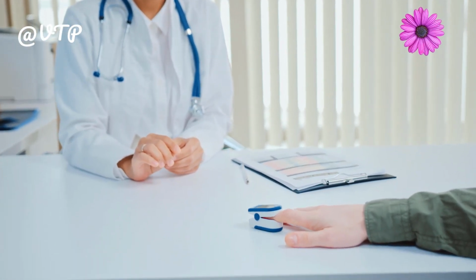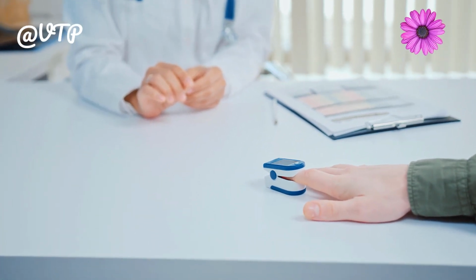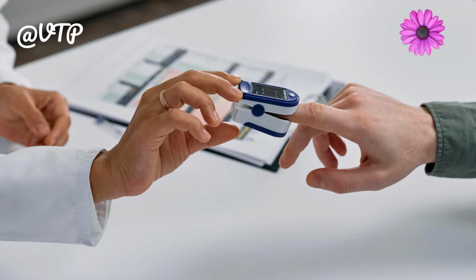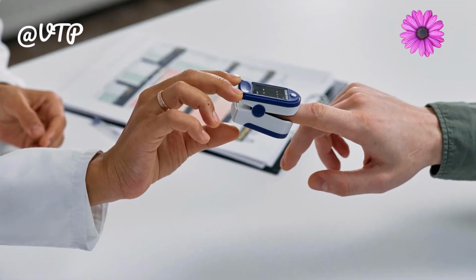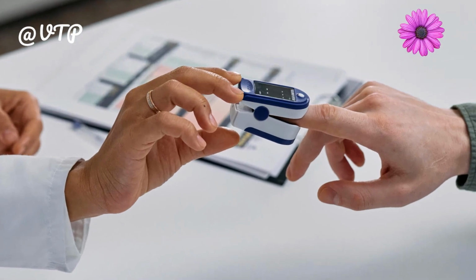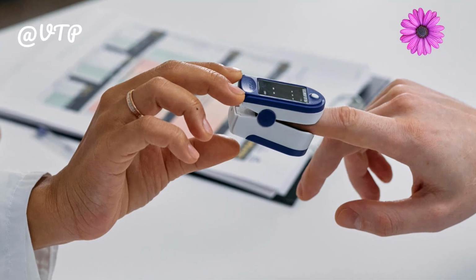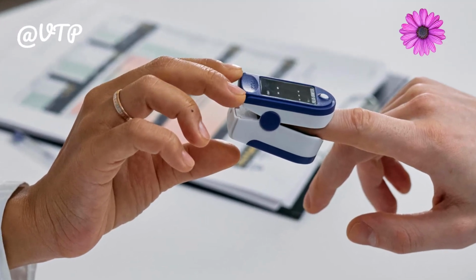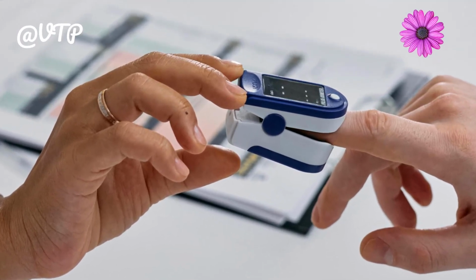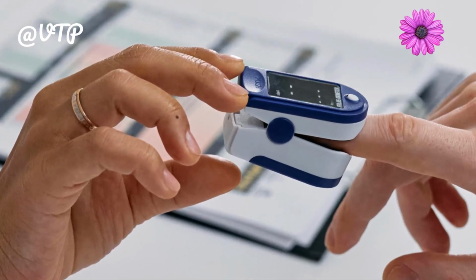In the intricate web of modern healthcare, where every heartbeat and breath matter, one tool stands out as a beacon of continuous vigilance: pulse oximetry. As the silent sentinel monitoring heart rate and oxygen saturation, its ubiquitous presence in patient care settings is both reassuring and essential. However, amidst the rhythm of routine practice, a subtle divergence emerges between tertiary and non-tertiary units, raising questions about the uniformity of its application and its impact on patient outcomes.